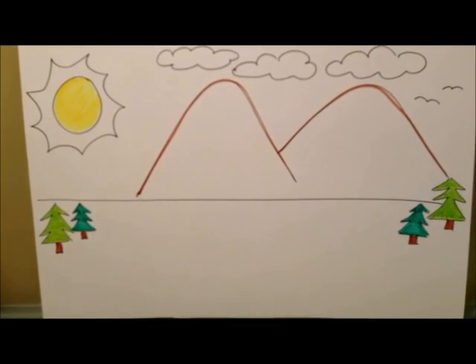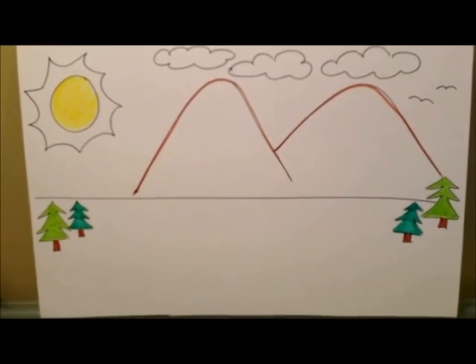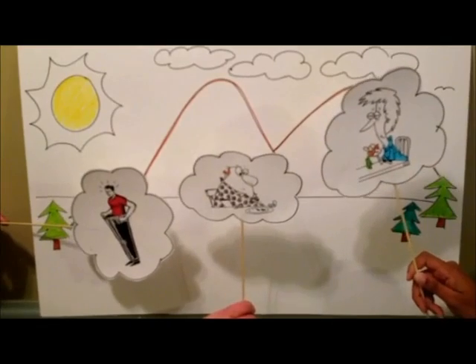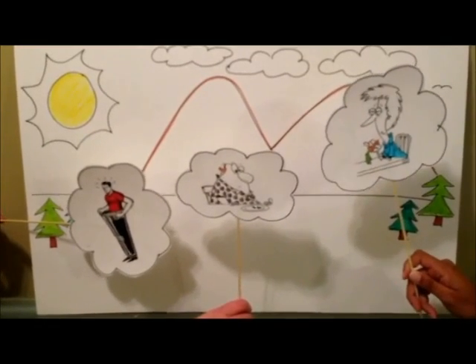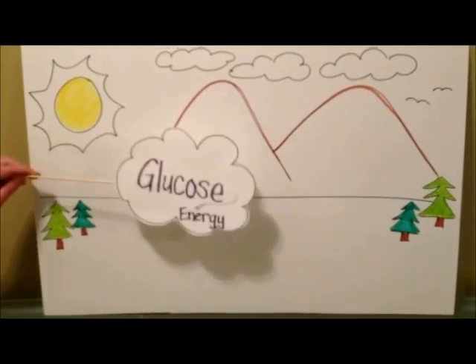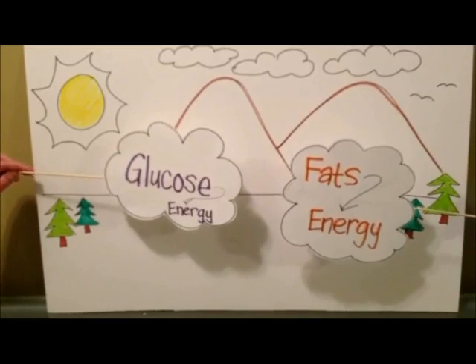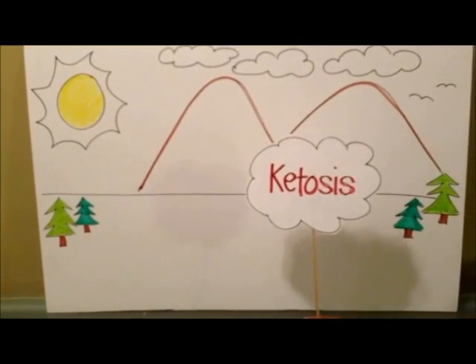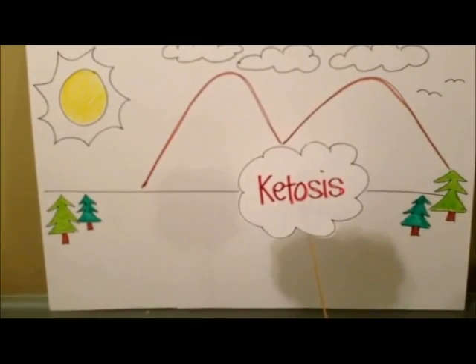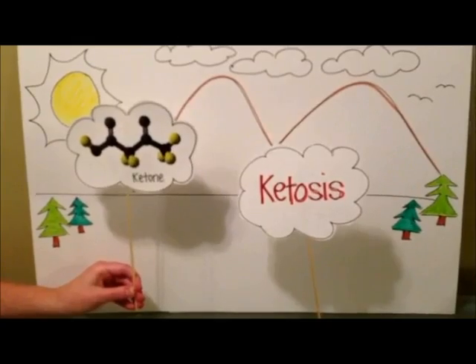For healthy patients, this tool can be used to determine if the body is in fact burning fats. For example, patients on an Atkins diet or ketogenic diets consume fewer carbohydrates so that they switch their body's metabolism from metabolizing glucose as energy to converting stored body fat into energy. This process is called ketosis and begins when insulin levels are low. Typically, patients on low-carb diets will only see small amounts of ketones versus those that are diabetic patients.